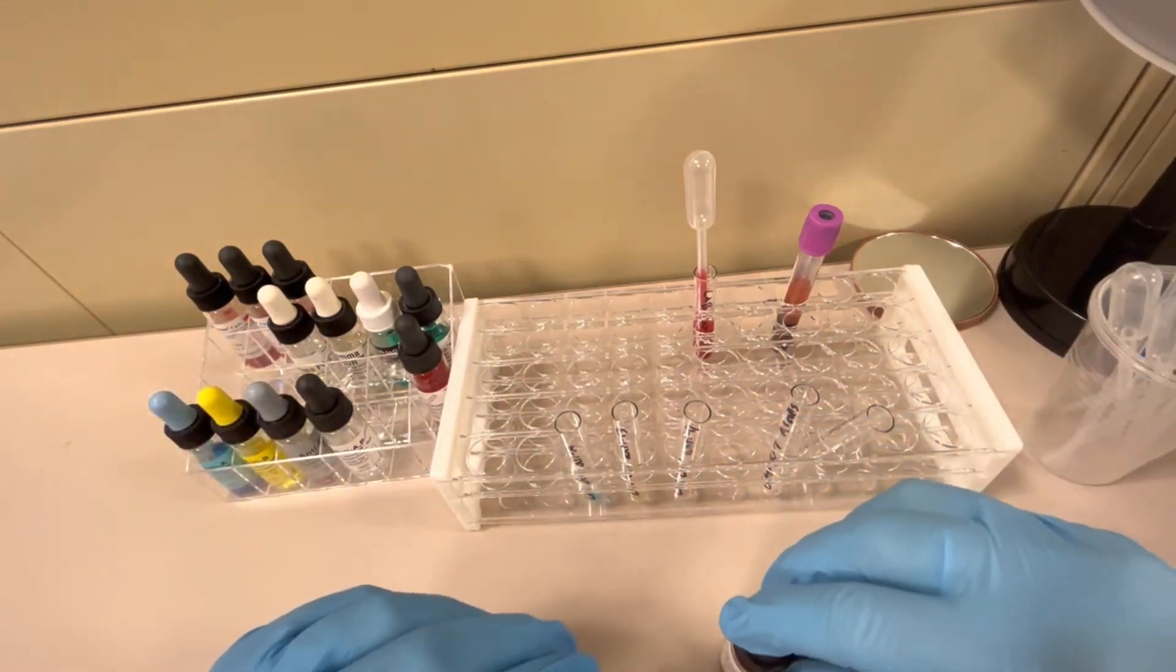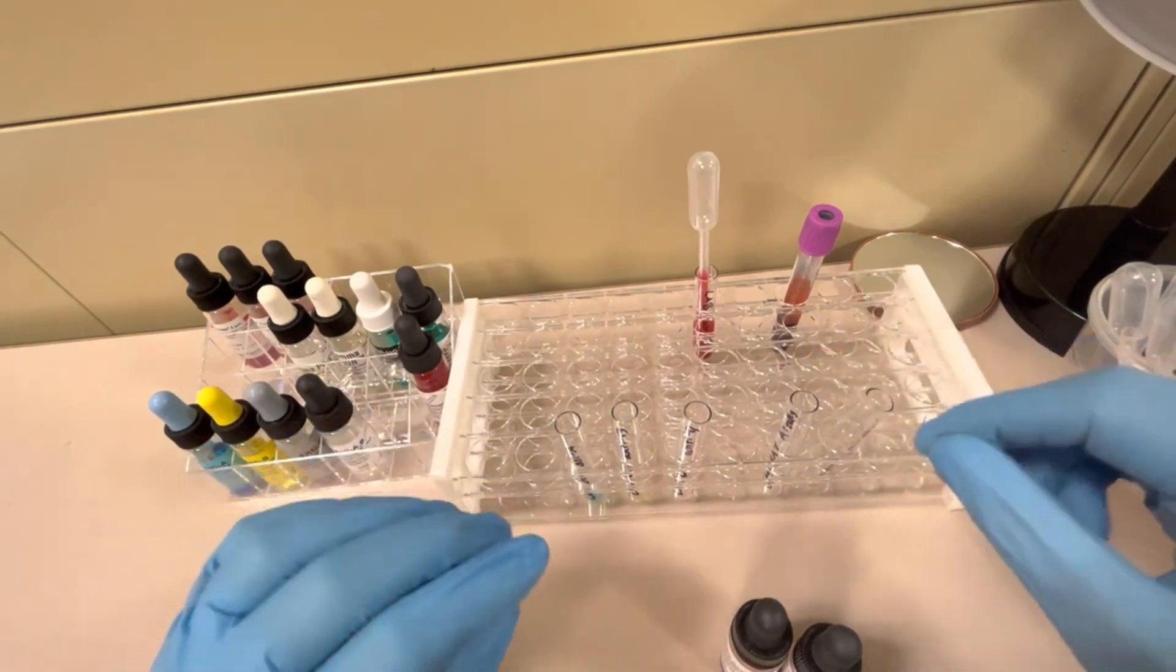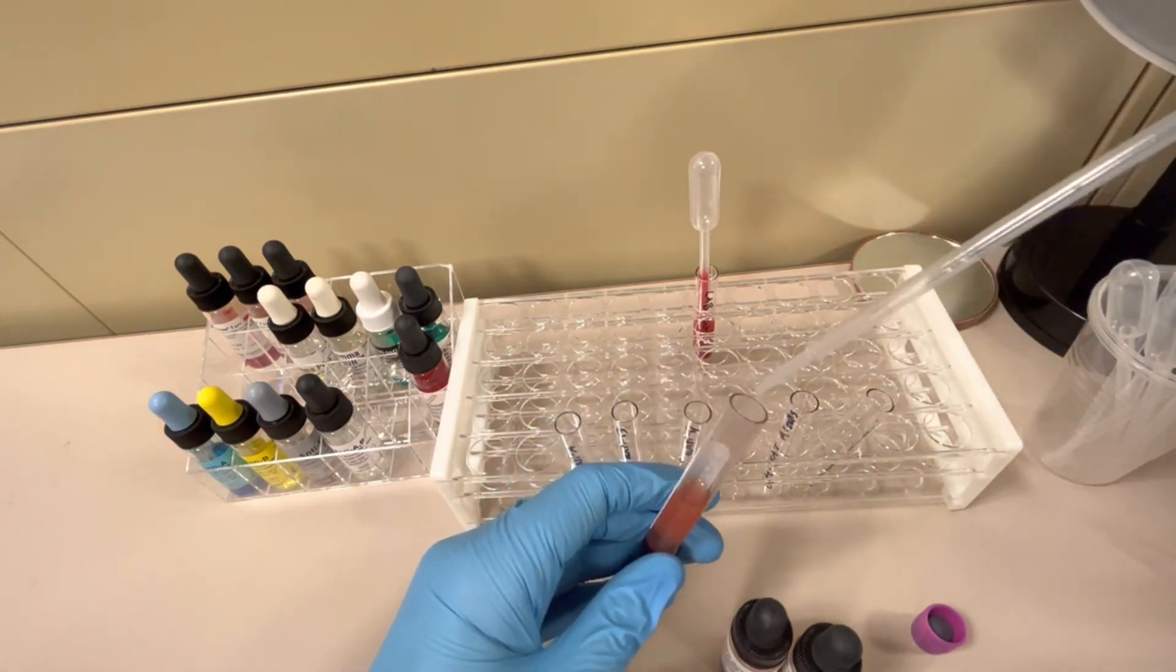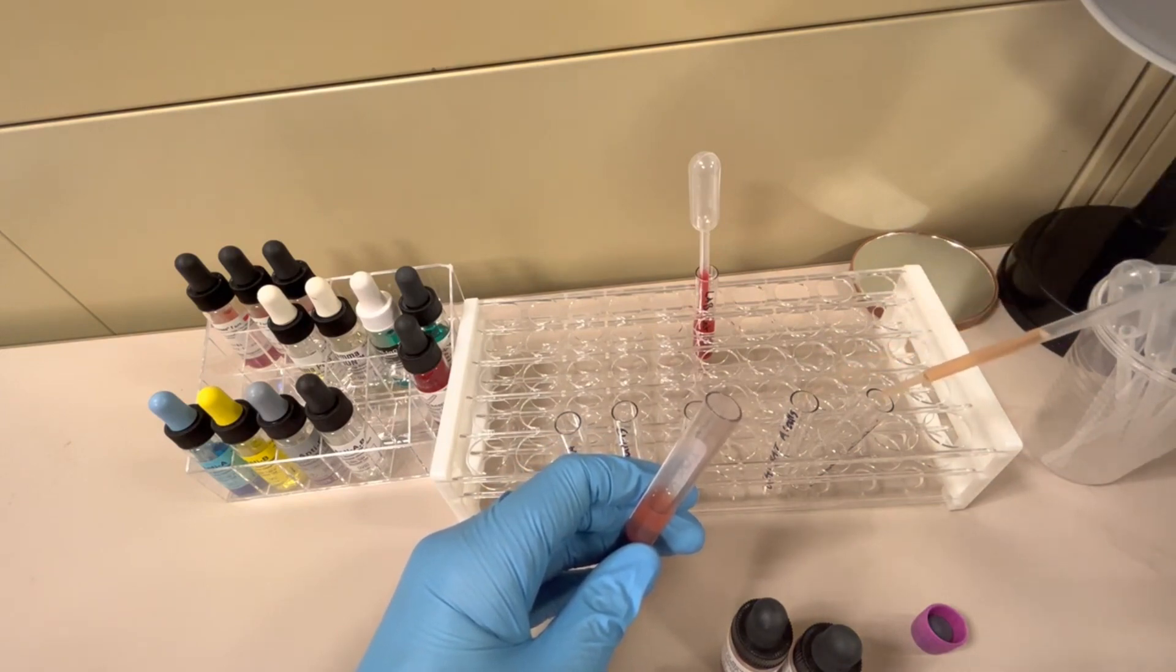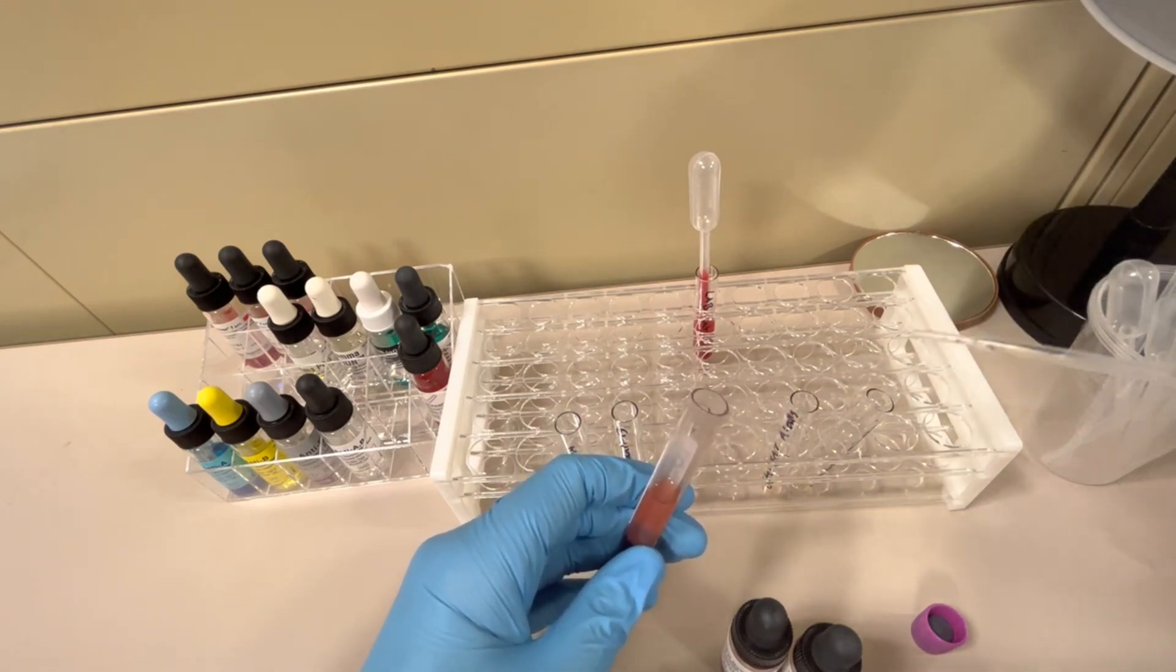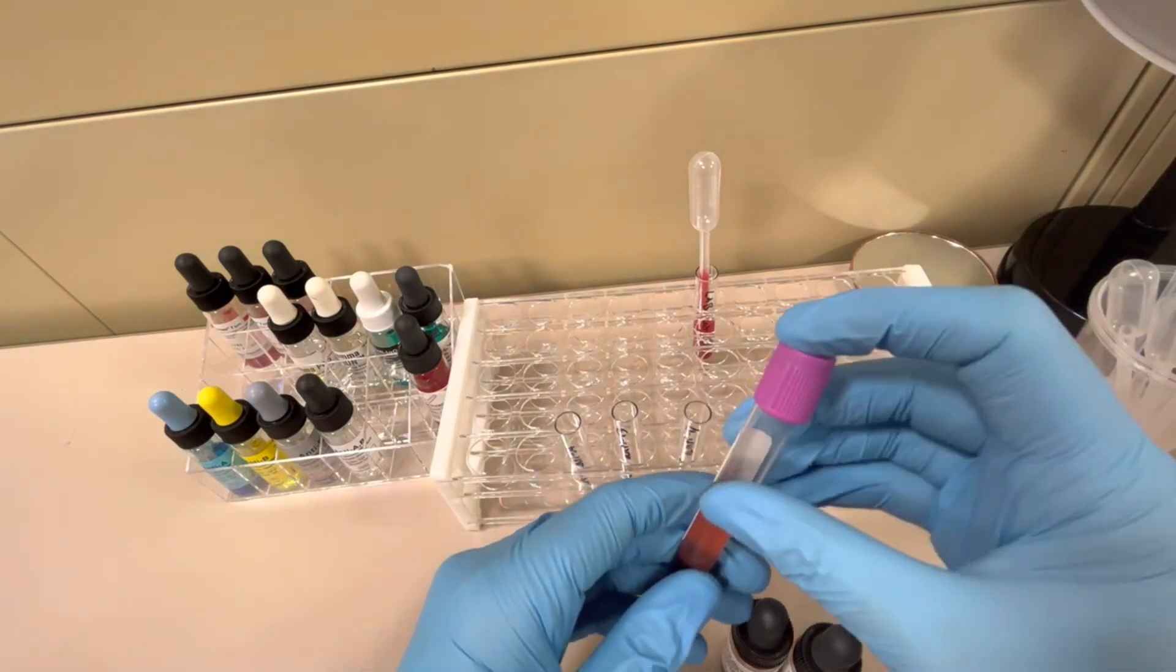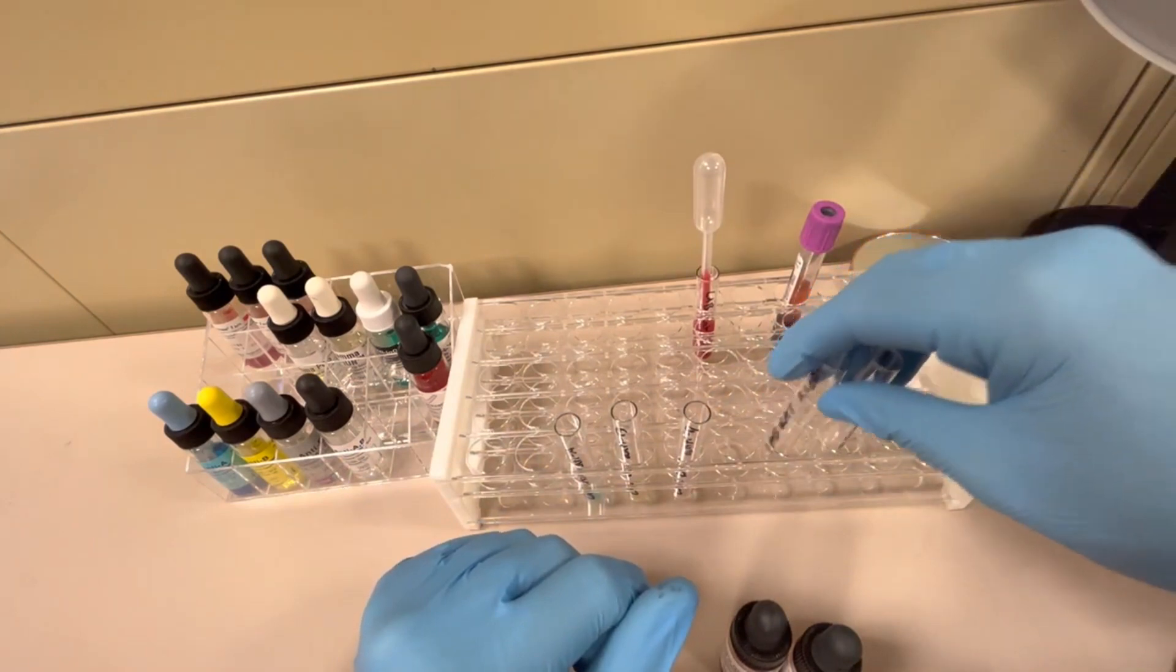I follow this rule: I always put the clear reagent or patient specimen into the tubes first. So I'm going to take my patient specimen, take the top off, and I'm going to add for my back type two drops in each of these tubes, because we're testing the patient plasma against known reagent red cells. Off screen, I'm going to dispose of this into a biohazard container and put the tube cap back on.